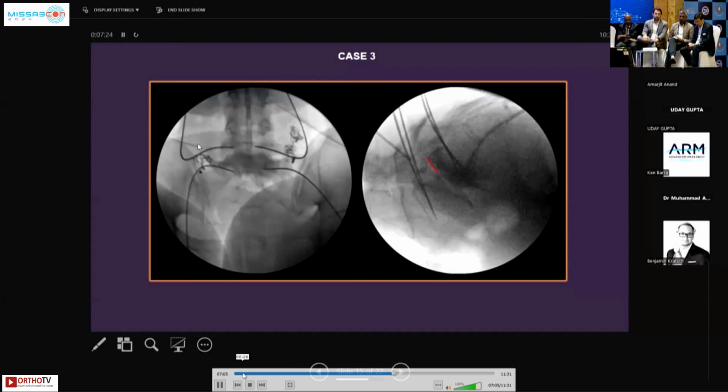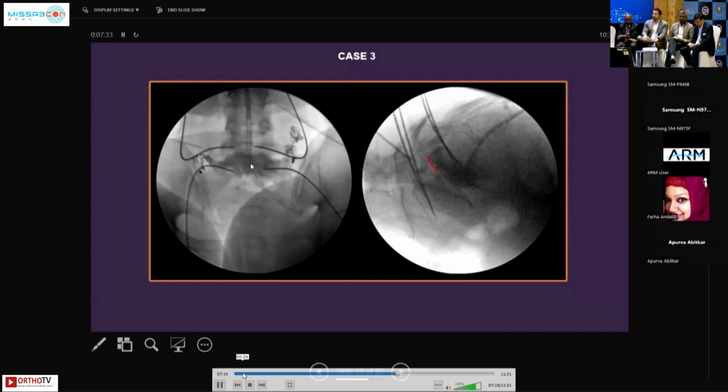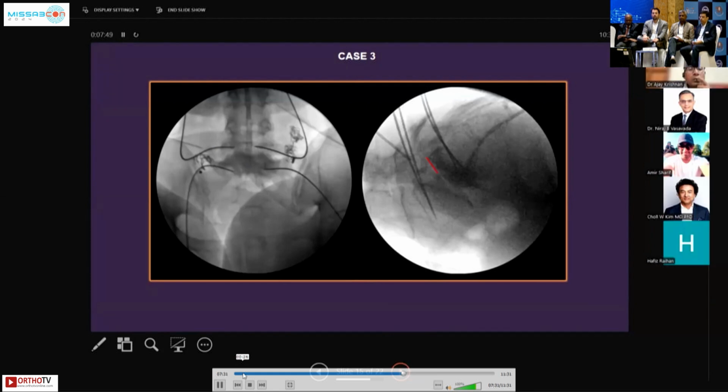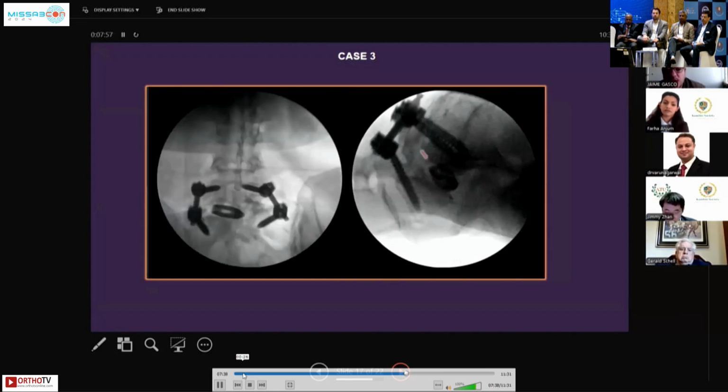measurements. But before making the incision, I take what I think is the correct entry point, and I use the needle to guide me to the trajectory and tell me that indeed I am going to be able to get in there. I find this extremely useful, and I would encourage people to incorporate it when you're not sure where to do the entry point for your incision, especially in those cases with a little bit of morbid obesity or some anatomical variations. And the rest is the same: working channel, the distraction, and preparation for your cage placement.